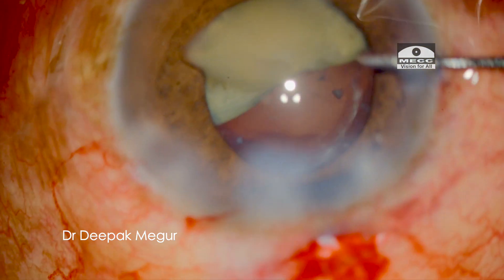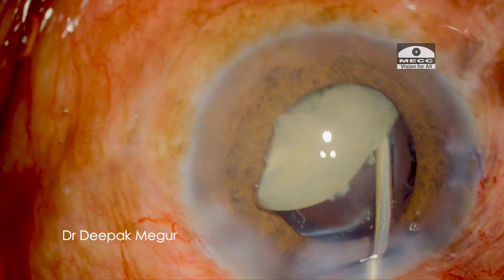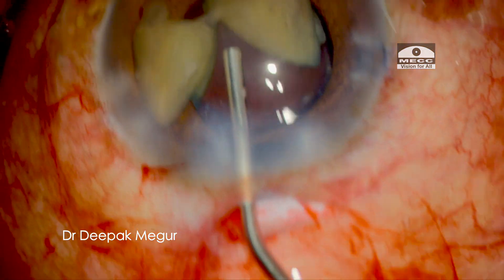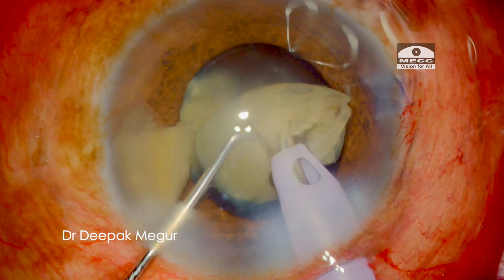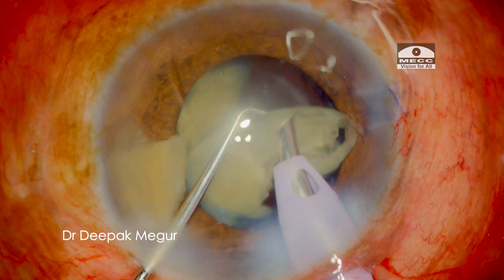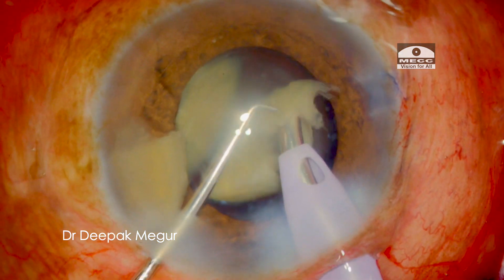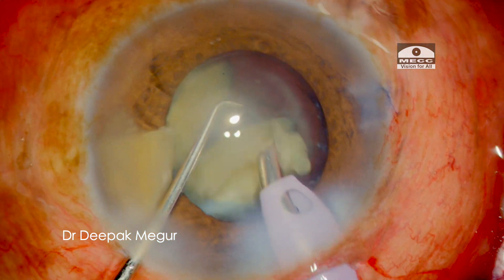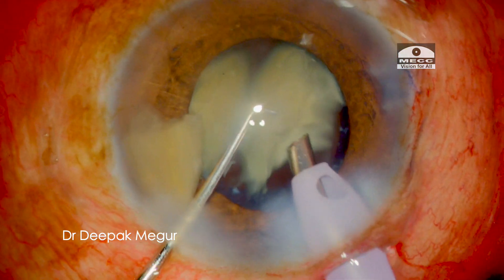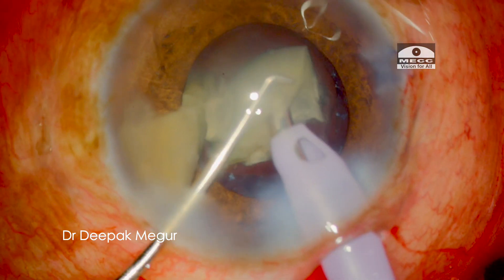The easiest option I usually use is to phaco out the portion of the attachment to the posterior plate, and then all the fragments will be freed. But in this case it is not safe to emulsify in the bag as the bag is totally empty. So I decide to manipulate the nucleus into the anterior chamber under the cover of viscoelastic, then phaco out the part of the posterior plate holding it together. Once done, all the fragments are loose and each is emulsified, though I am forced to emulsify them in a much more anterior plane, contrary to my usual recommendations.